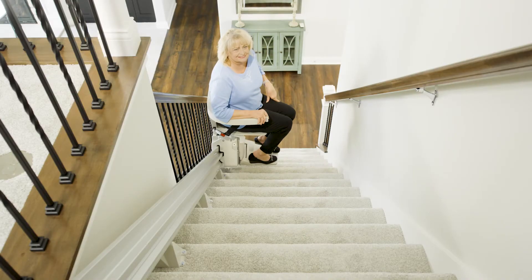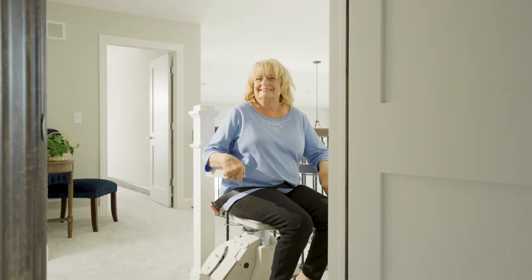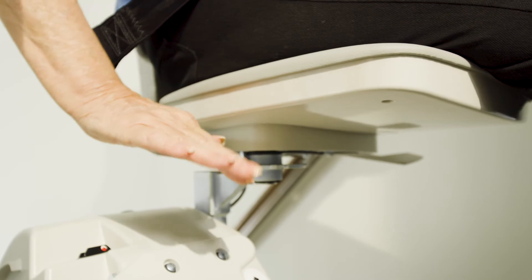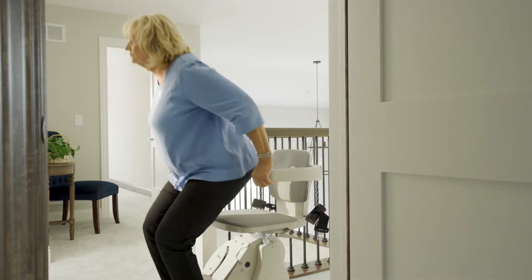The Elan can be operated either by armrest control or a wireless remote. When the Elan stops at the top of your staircase, pull the lever and the seat extends and swivels up to 90 degrees to enable a safe exit away from the steps.